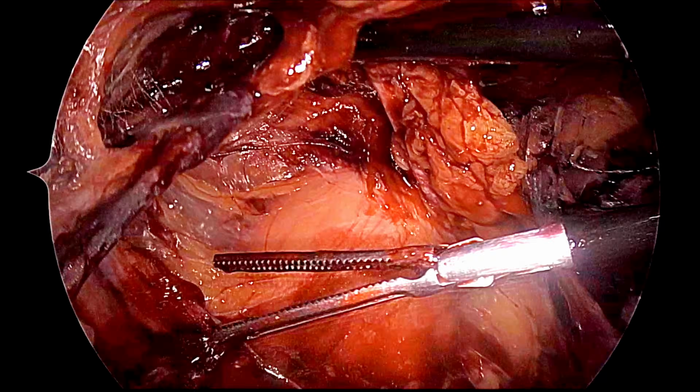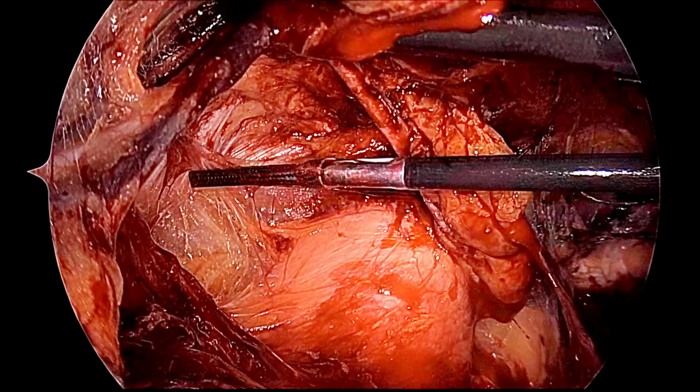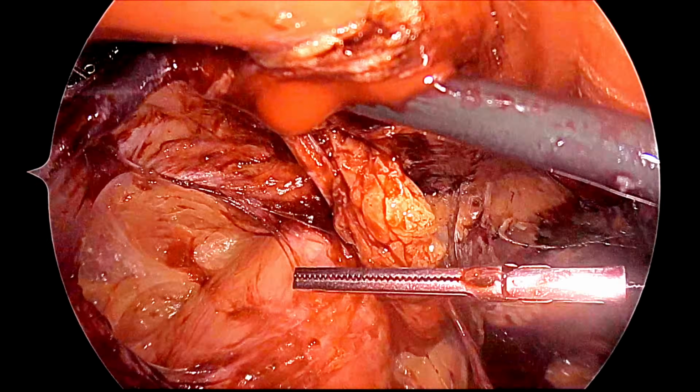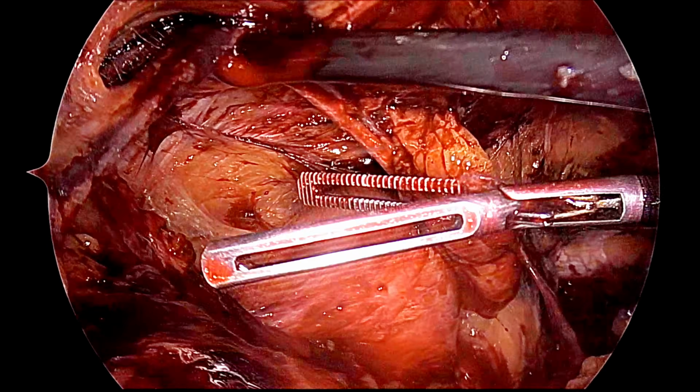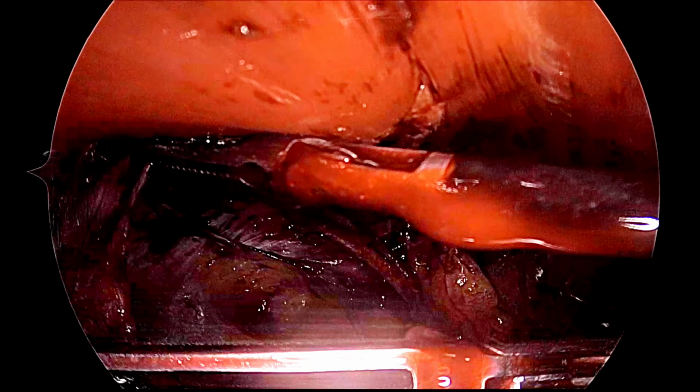Here we can see this is the sac and this is lateral to the sac. Here we are lateral to that, and this is the inferior epigastric vessel which is kept towards the anterior abdominal wall, and this lateral dissection is going on.